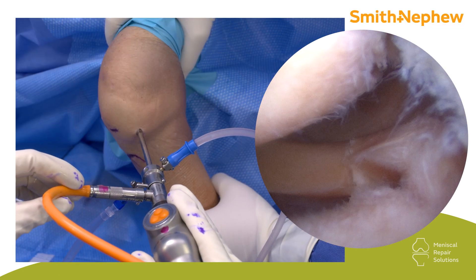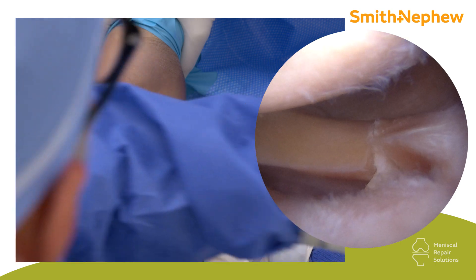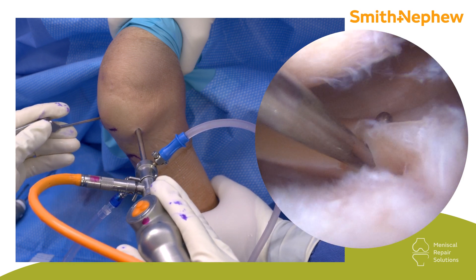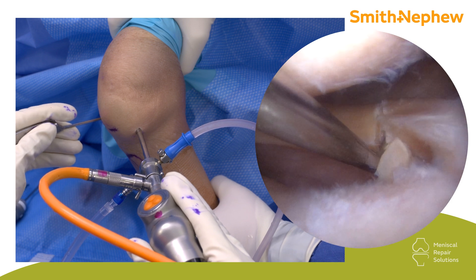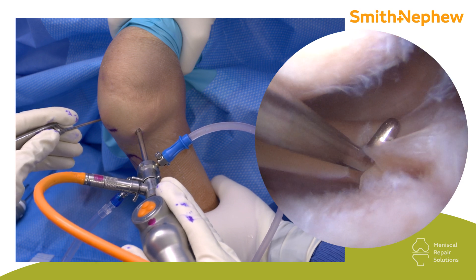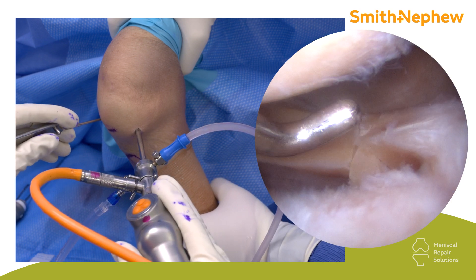In your typical ACL tear, commonly you have a lateral meniscus root tear. If the root isn't completely off — like in this particular case here — there's still a soft tissue component on the lateral root. It's a so-called ELMORT tear, or lateral meniscus oblique radial split tear. These are very important to treat. This is not just a small tear that you may resect — this warrants fixation.